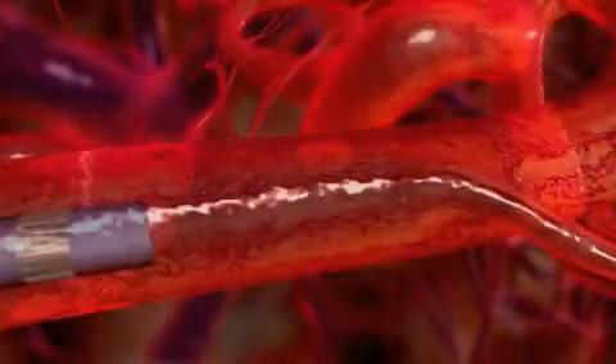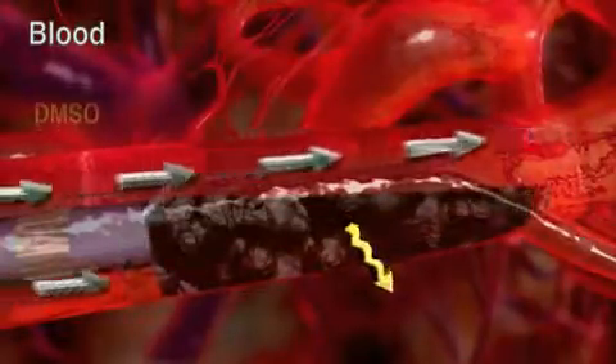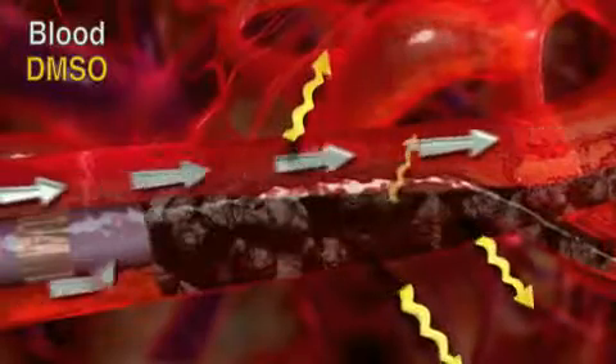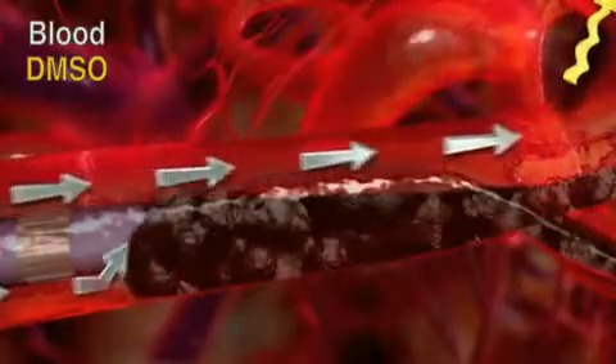Onyx advances because it is pushed. Often compared to how lava flows, Onyx begins to solidify from the outside while the inner core remains liquid for a given duration. Onyx follows the path of least resistance. At times, flow dynamics within the nidus can make that path retrograde, causing the Onyx to reflux. During most Onyx procedures, reflux is likely to occur. The amount of acceptable reflux should be determined in advance. The moment reflux is detected, stop the injection for a duration of 30 seconds to 2 minutes, allowing the Onyx to solidify at the site of reflux. Do not exceed 2 minutes. Resume the Onyx injection until reflux is again observed. This should create a plug around the catheter tip.